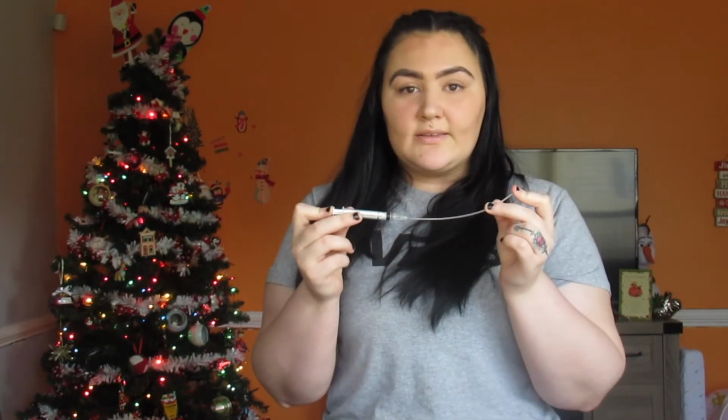So once I found her cervix, I went ahead and I grabbed the syringe that had the sperm in it, and I'm going to show you guys that as well. This is what the syringe looks like. It's not a turkey baster. A lot of people think when lesbians say they got pregnant at home, they used a turkey baster. Honestly, I don't even think a turkey baster would work, so I wouldn't even try that. But it's just a syringe that looks like this.